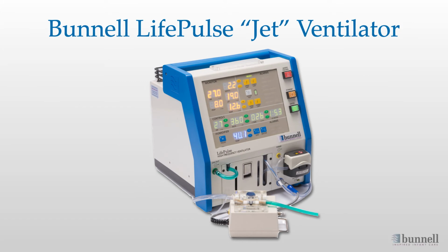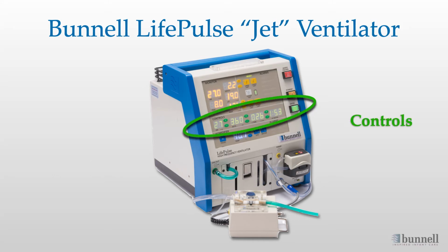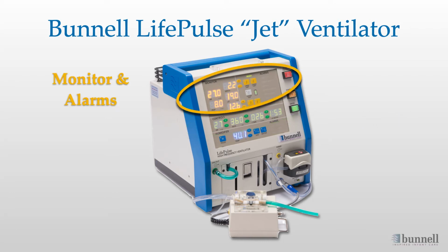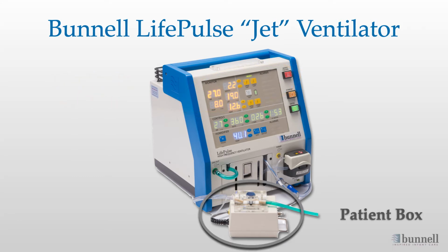The remainder of this presentation will focus specifically on how the jet is used in the care of patients. The lower portion of the ventilator with the blue numbers is a humidifier. The center section, labeled Controls with the green numbers, is where the current ventilator settings are displayed. The upper portion with yellow numbers contains both the monitoring and alarm sections. These two sections are where the clinician will see the monitored values and be alerted to changes occurring with the patient. The WhisperJet patient box makes jet breaths and measures pressures at the patient's airway. It is placed into the bed with the patient.